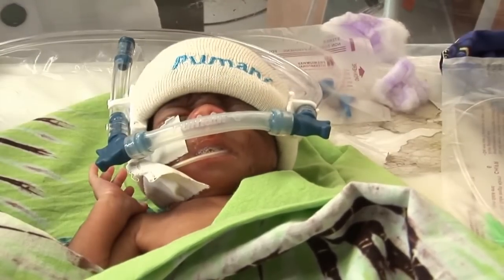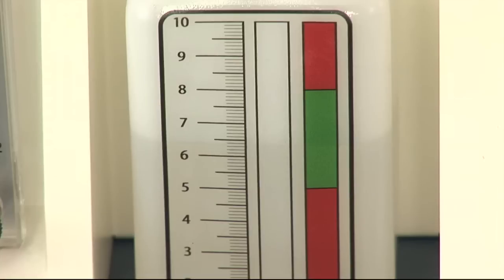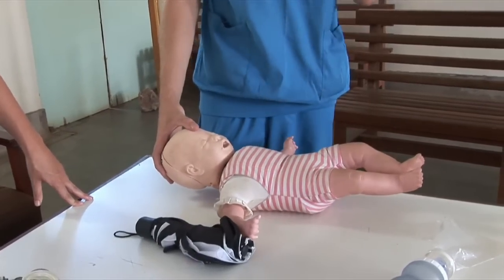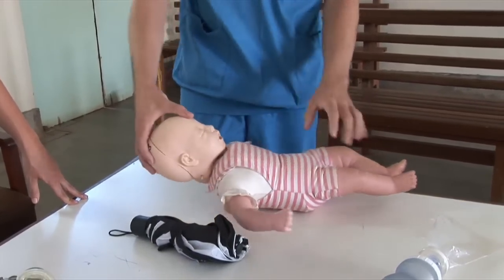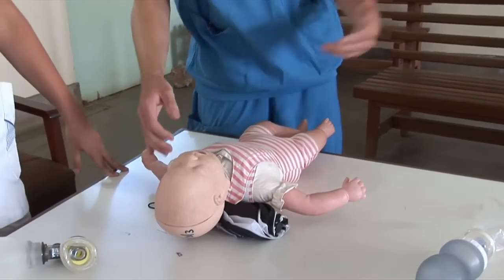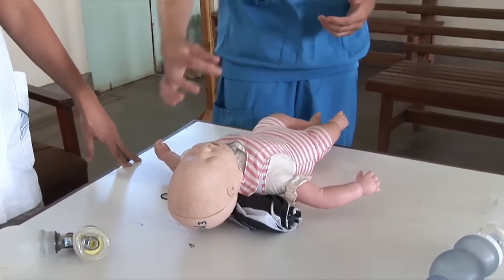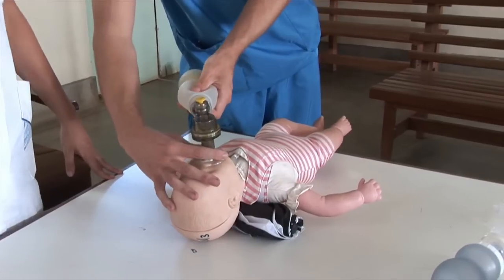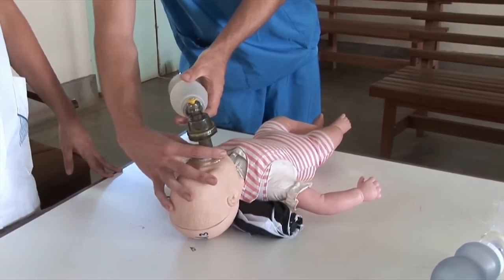If the prongs are well placed and the machine is functioning correctly but the water still does not bubble, you might need to position the baby to improve the airway opening. You do the same thing as during emergency resuscitation: place a small roll of cloth, blanket, or pillow under the baby's shoulders. This is anyway the best position for the baby to breathe.